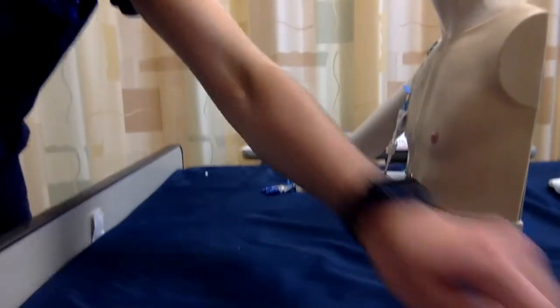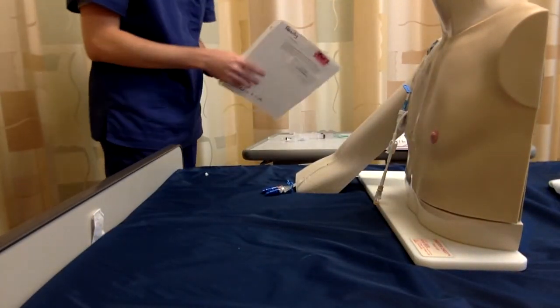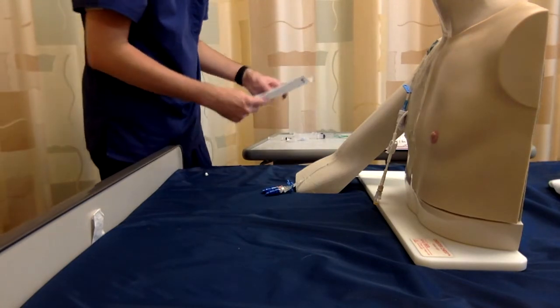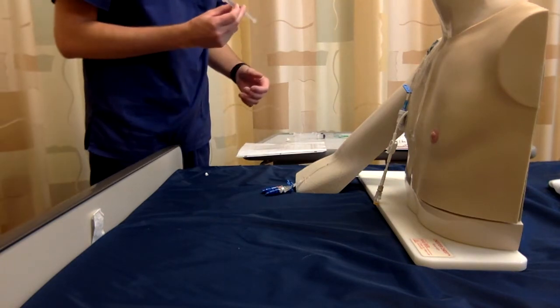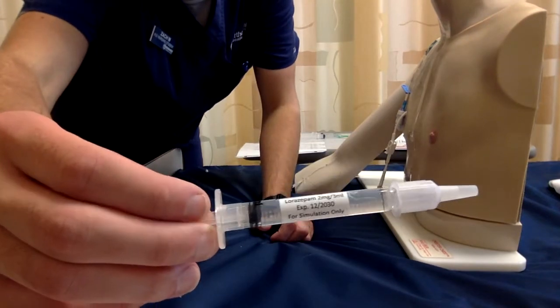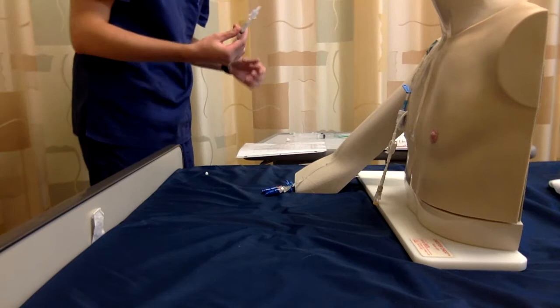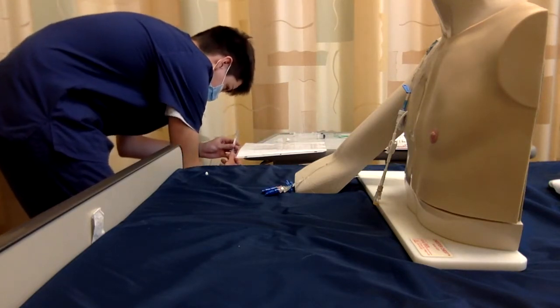Alright, so the first thing I'm going to do is check my order. So I see that Bob Owens here has Lorazepam 1 milligram IV push every 3 hours for anxiety. So I go to Pyxis, get my medication. It is Lorazepam 2 milligrams in 3 mils. I'm going to wash my hands and I'm going to waste it now. So put on my needle access device and waste.